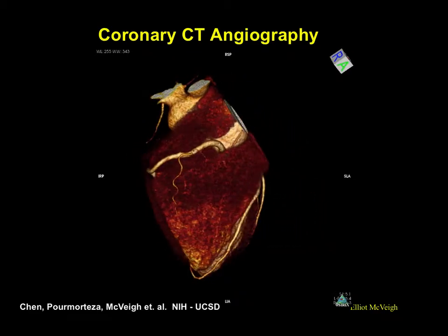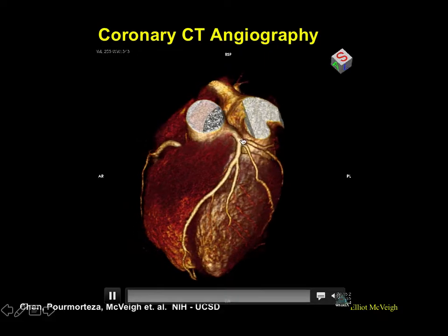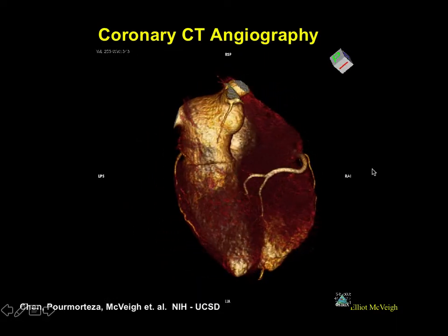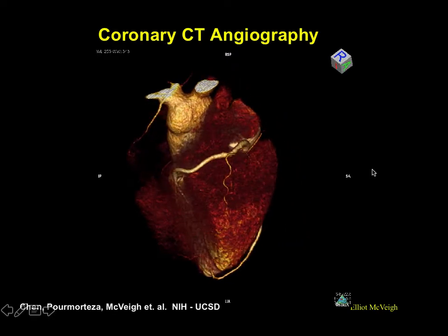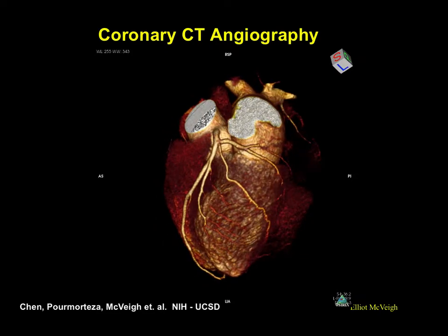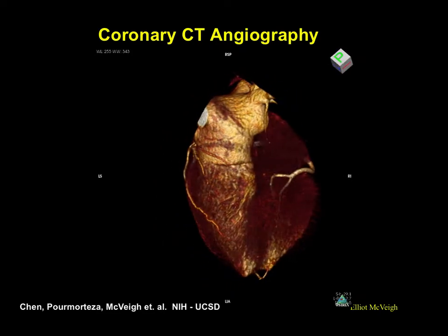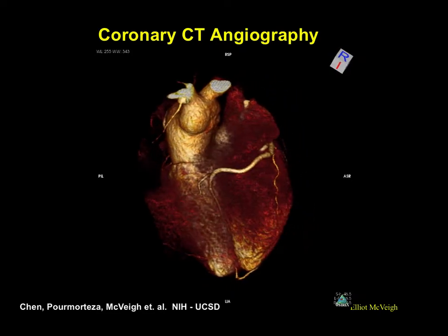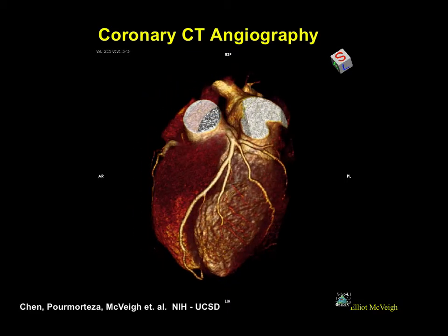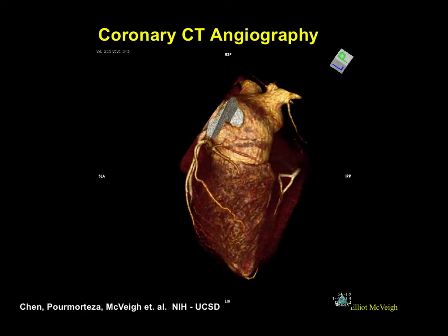So you can see the basic resolution now of CT, the nominal resolution, when you ask, well, how big is a voxel, as you've seen in the header or the images that you've looked at, is about 0.4 by 0.4 by about 0.6 millimeters, right, for the dimensions of a voxel. That's not the resolution, obviously, of the scanner.